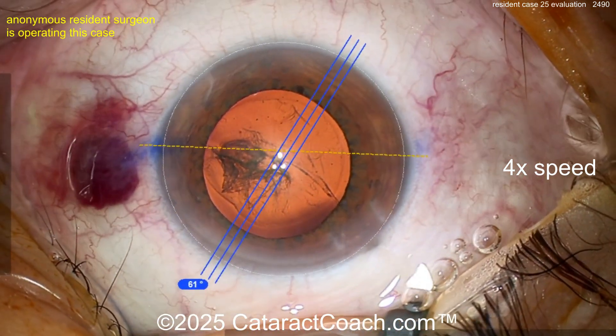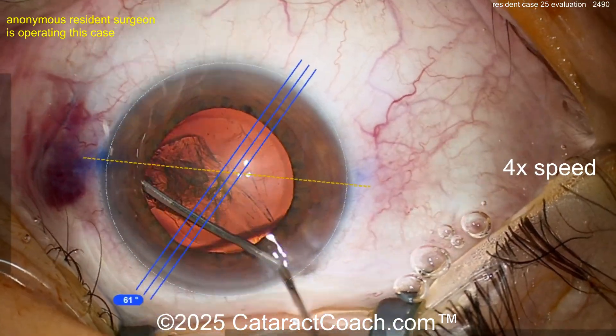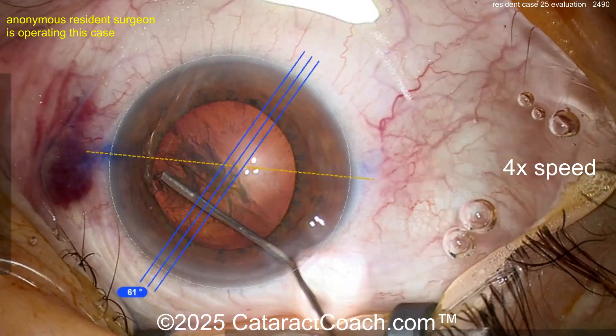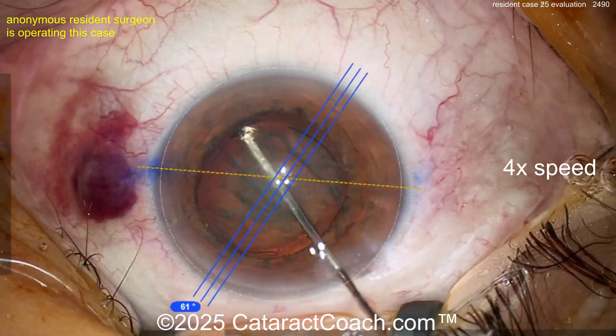That's really, really good — a great Rex for case number 25. See the incision there, it's a little bit too avascular for me, but it's not bad at all. It's a reasonable incision.